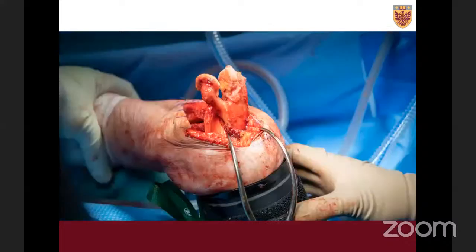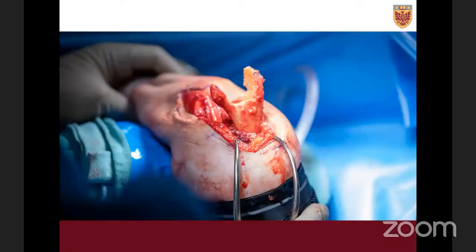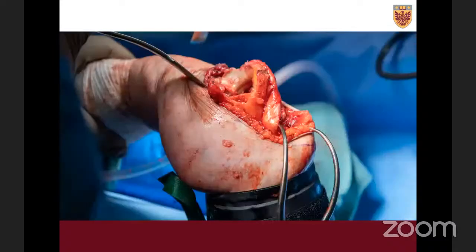You can start preparing either component first — I usually prepare the ulna first, but this example shows the humerus prepared first. This is standard preparation of the humerus using a cutting guide from the Striker Latitude system, which is usually my preference of implants. The approach can be used regardless of which implant system you're using. Once the humerus is finished, you work on the ulna. As you supinate more, you have an excellent view of the ulna face-on.